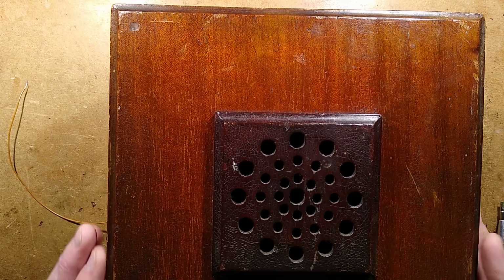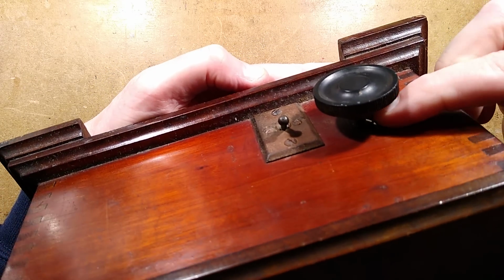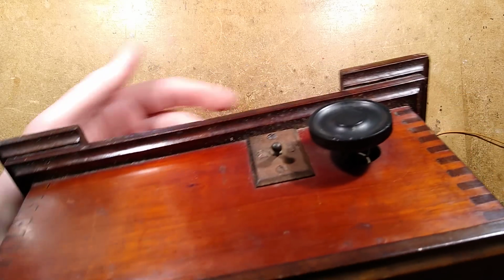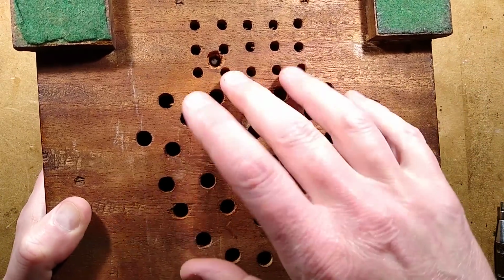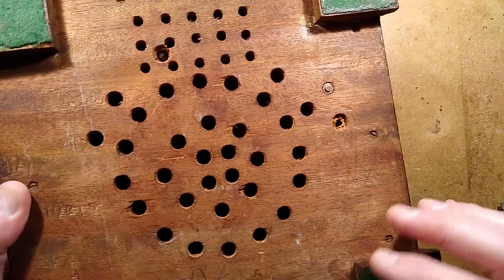I've tested it. On the other side we have a turning knob with bare live bits down here, and a switch that breaks the circuit in a very odd way, and we've got these lovely ornate feet. And the underside of it doesn't look so pretty, but it's clear that they've all been handmade, and this one has been stamped with the serial number.